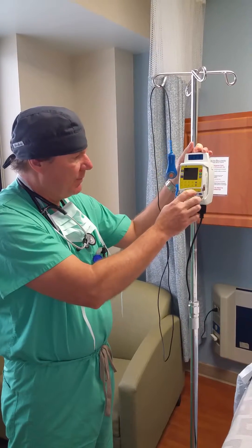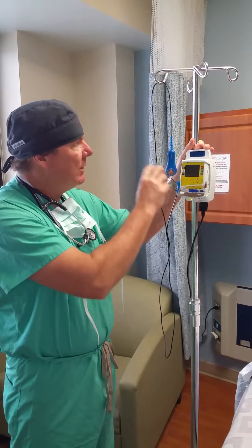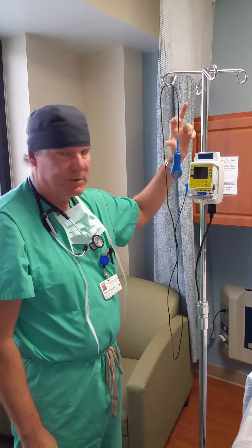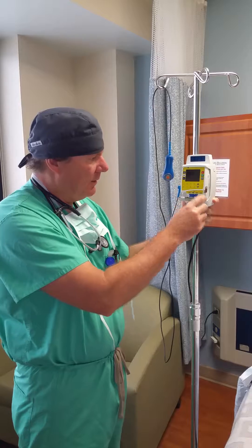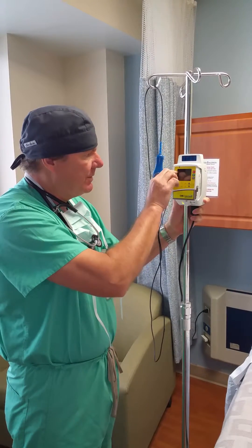The way it works is we put a bag of ropivacaine, which is just a local anesthetic, in here.